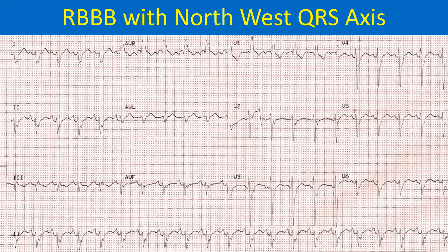The QRS pattern in chest leads shows a clockwise rotation with S waves persisting up to V6. The slurred R' in V1 and slurred S waves in lateral leads suggest delayed activation of the right ventricular myocardium, which proceeds by conduction through the myocardium rather than through the specialized conduction system of the heart.